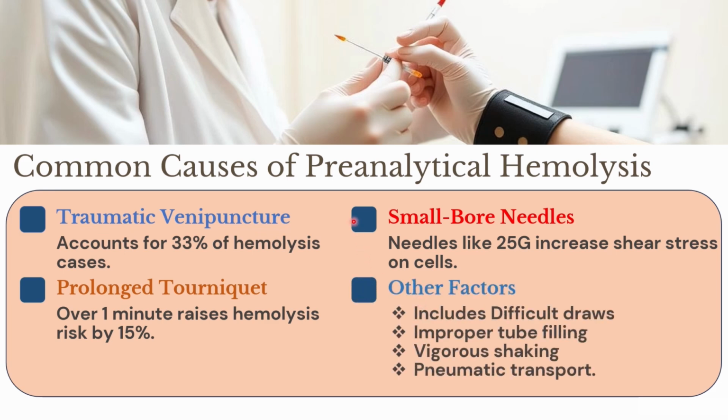Then apart from these causes, we have various other factors like difficult draws, in which we pull the plunger of the syringe forcefully, or if we are not filling the sample tube properly, or vigorous shaking of the sample, if we are not properly inverting the tubes and are shaking them, that can also lead to hemolysis. Also, pneumatic transport of the sample can lead to hemolysis.